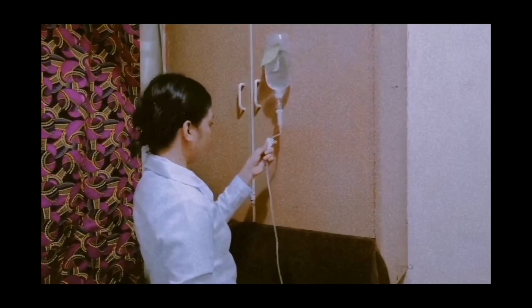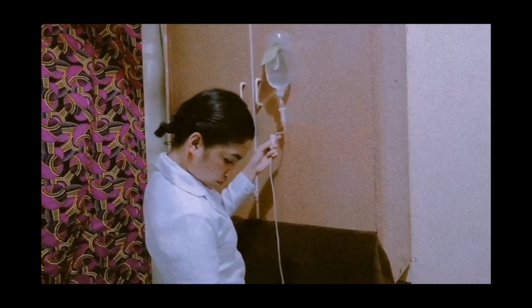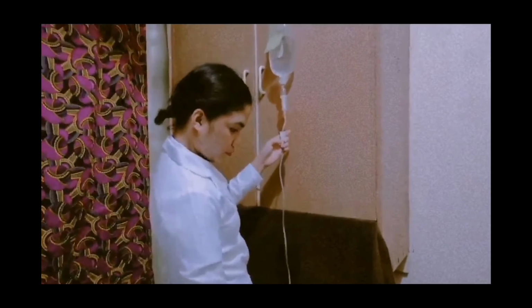Next is to observe patency of IV tubing. IV line must be free of kinks, knots, and clots for fluid to infuse at proper rate.